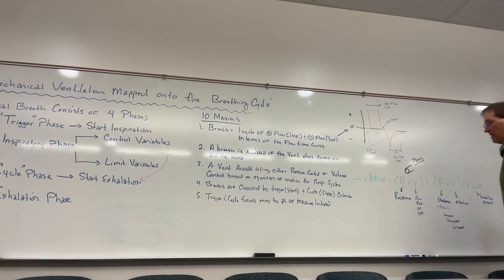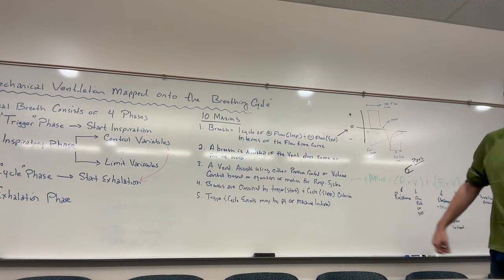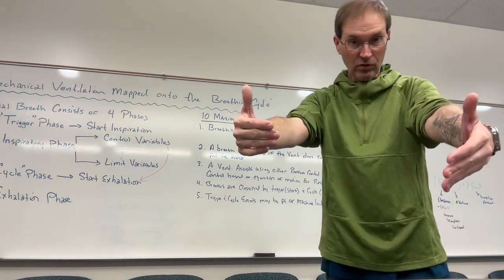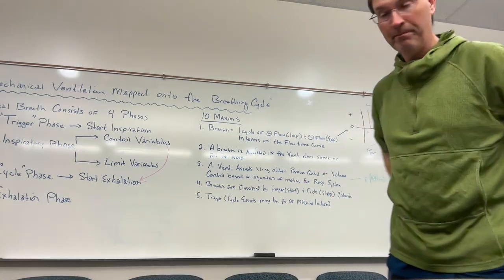P applied, that is the applied pressure. So that is essentially the pressure the ventilator has to deliver to push air into the respiratory system.